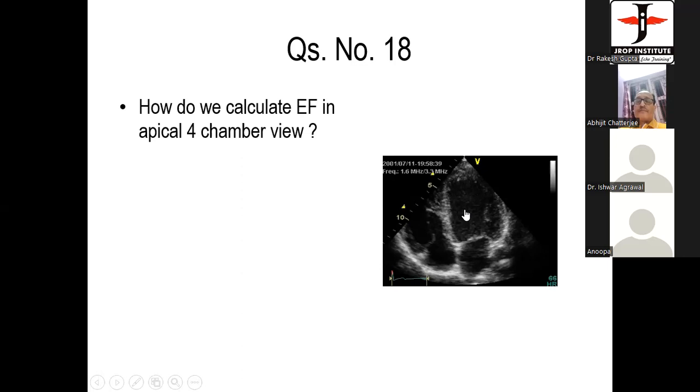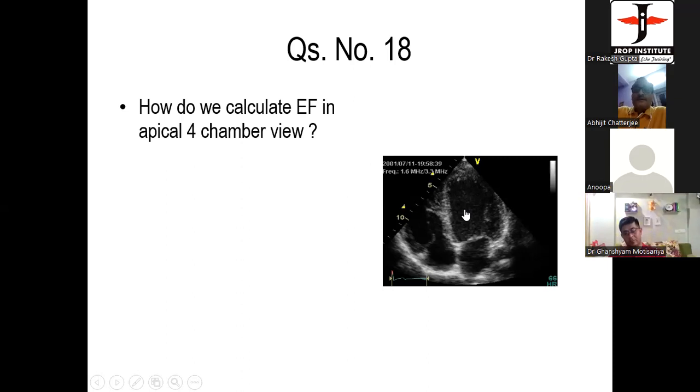Yes, just screening. You're doing screening. Very good. Now, tell me how to do TAPSE. What does TAPSE mean? What do these letters stand for? Sir, it is tricuspid annular plane systolic excursion value. Very good. And how do you do that?